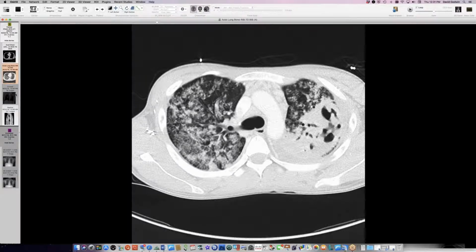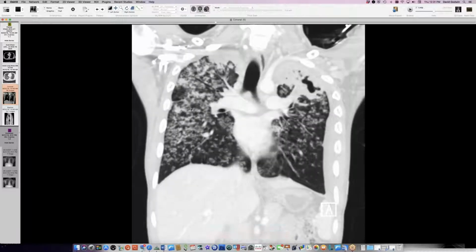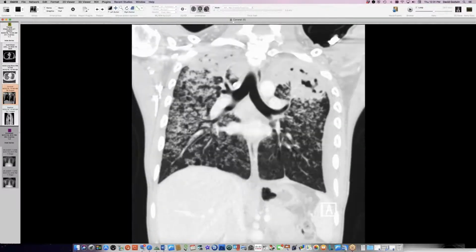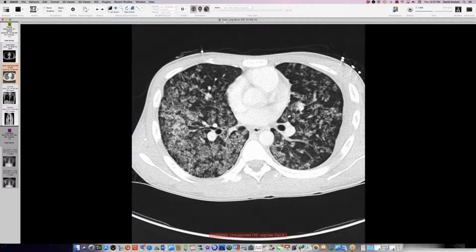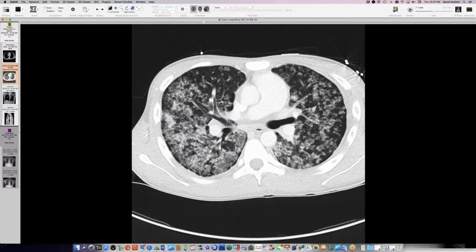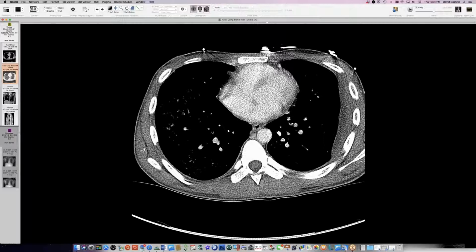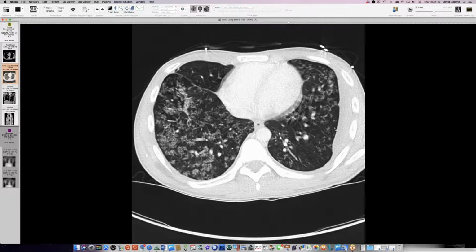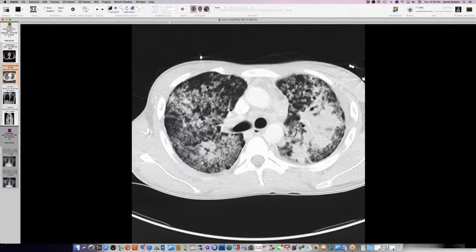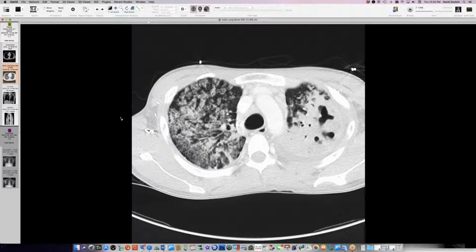So this is a case of florid tuberculosis here, and sort of an atypical filling pattern here of the lower parts of the lung. I've not been aware of this pattern before, it really looks like acinar rosettes here every place. I don't know whether this is familiar to you guys, but it wasn't familiar to me. And the fact that this pleural process is mature and old raises the question, did he have remote TB? But there wasn't any history of that as a cause of some pleural thickening here with some thickening of extrapleural fat. This is very mature looking, and I don't think it's part of the acute process. So TB at this point, and so far no other organisms identified, but truly florid disease.